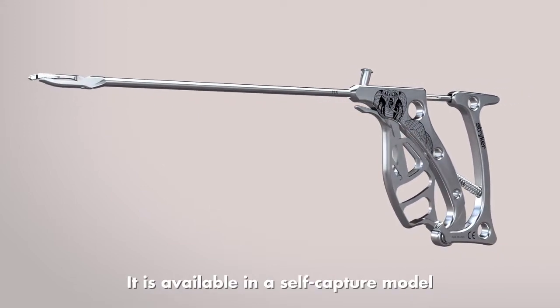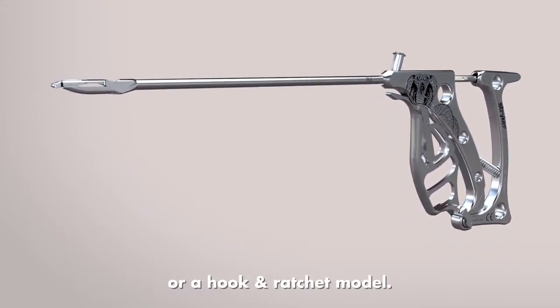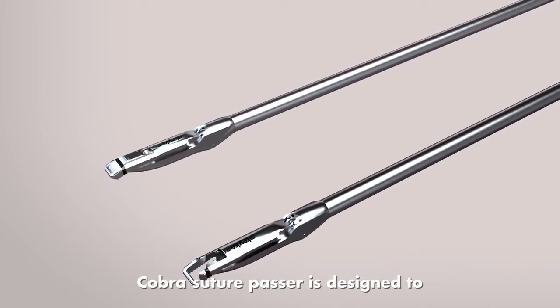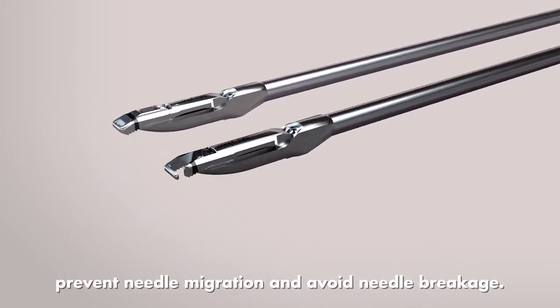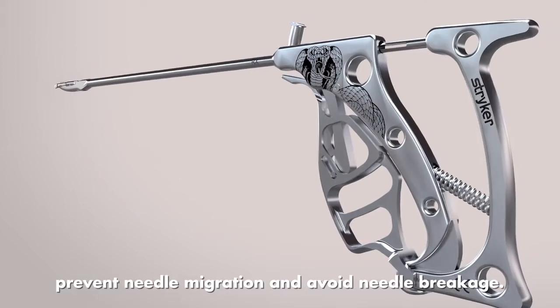It is available in a self-capture model or a hook and ratchet model. COBRA Suture Passer is designed to eliminate a disposable needle, prevent needle migration, and avoid needle breakage.